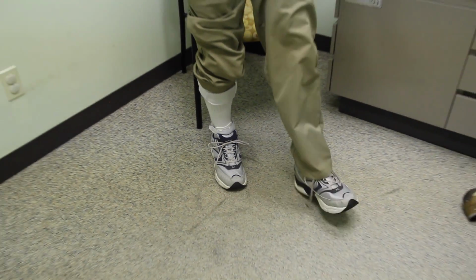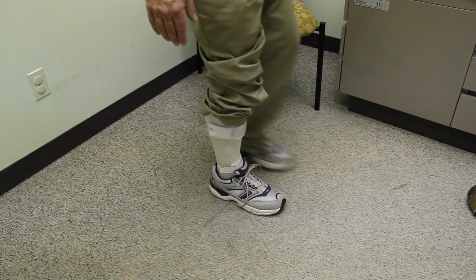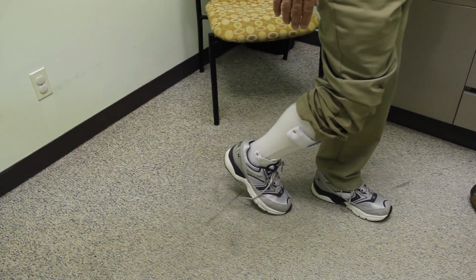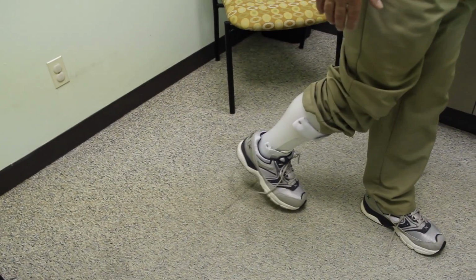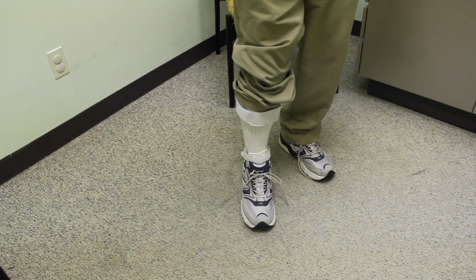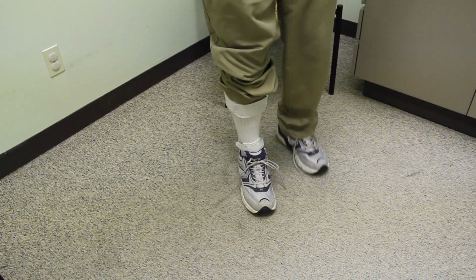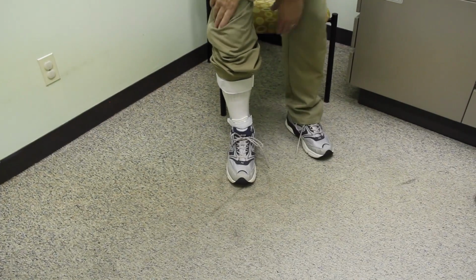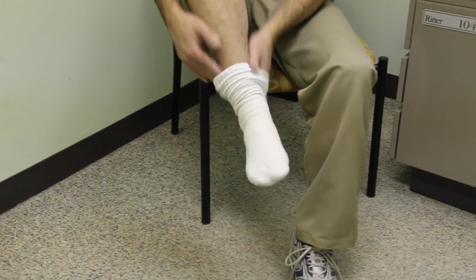When we start to walk, you can notice how when I roll off the toe, my heel doesn't pop up inside the brace. So it's a lot smoother walk for me. Once they walk and stand up on the brace, if they're not getting any pressure, we're going to take a look at their skin and make sure that there aren't any areas of impingement. And then remove the sock.